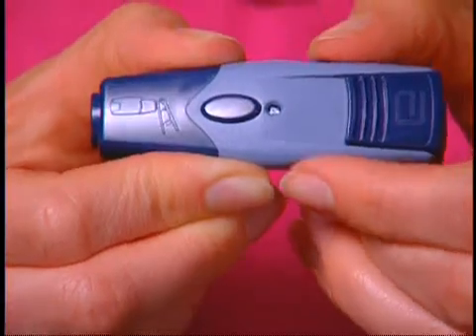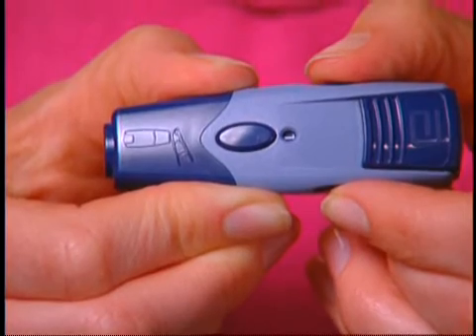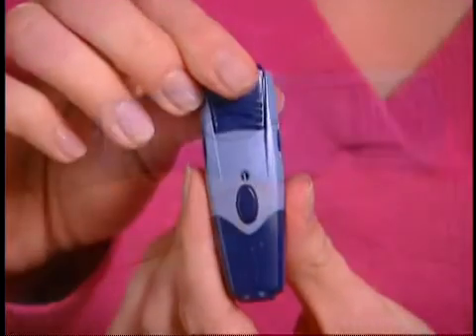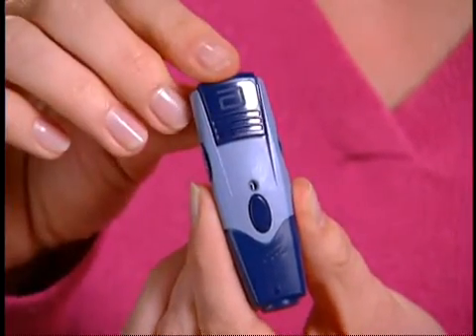Notice that our device offers four settings. You'll need to move your dial to the desired setting. To lance your finger, we recommend that you start with level one, as you see here. Then you can customize as you need. Pull the dark cocking handle out until it clicks. Now we'll set the lancing device aside while we proceed to the next step in testing — setting up the FreeStyle Light Meter.